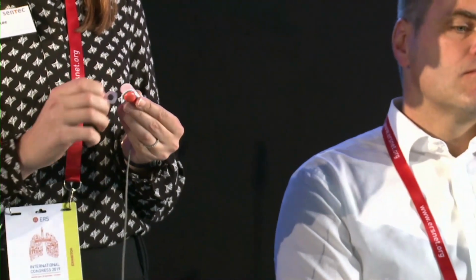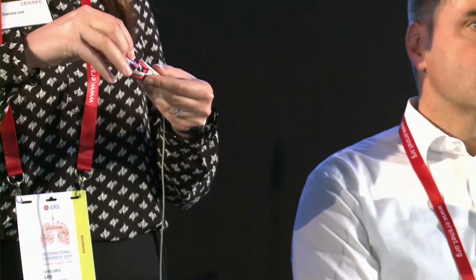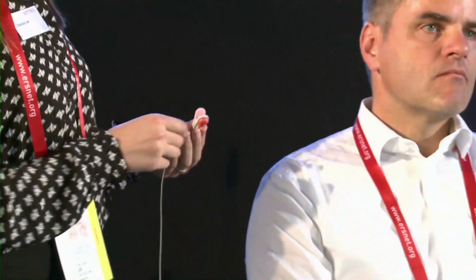Take the sensor out of the docking station and click the sensor into the ear clip. Remove the security flaps from the ear clip, and then we need to put one drop of contact gel on the sensor. The contact gel is needed to provide a tight seal of the measurement site against ambient air, so that no ambient air sneaks in and may cause a false measurement.